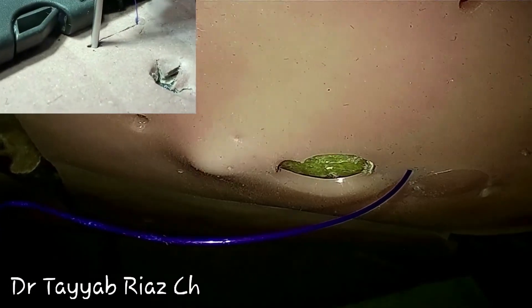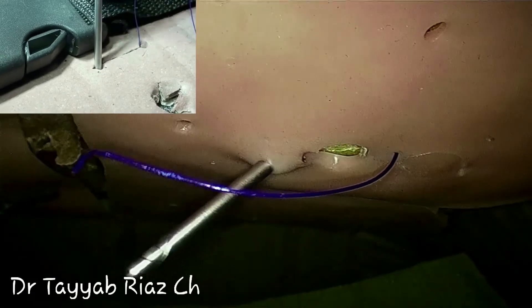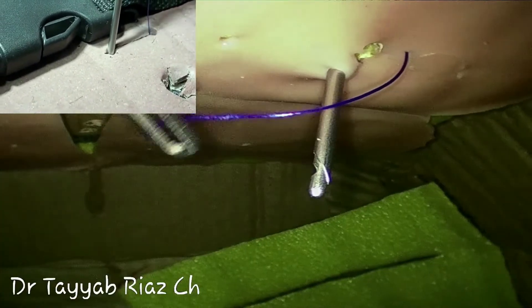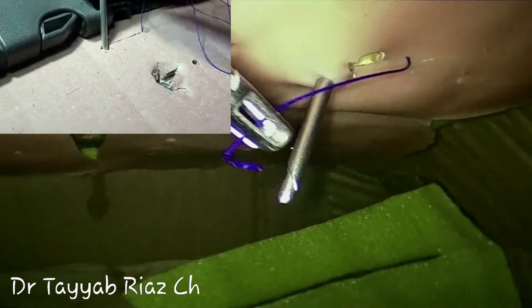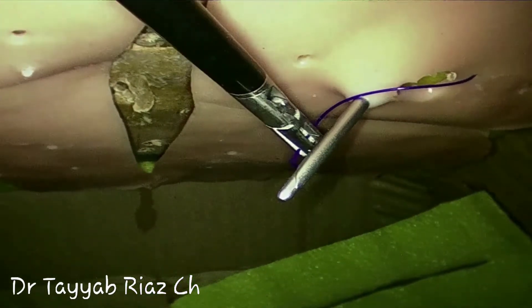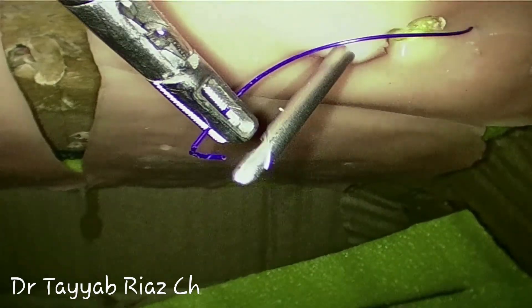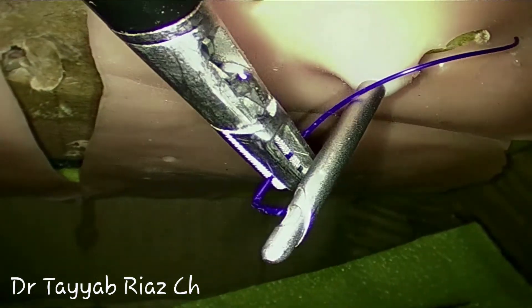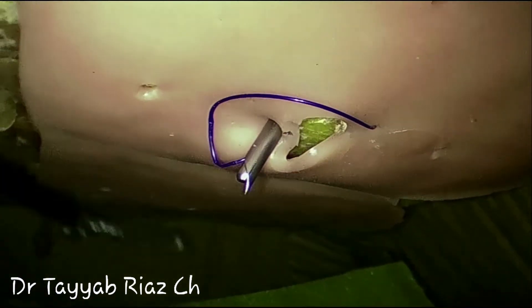Insert the needle again through the same 10 millimeter defect on the opposite side, again at the same distance. With the help of the left hand instrument, feed the end of the thread to the side eye of the Veress needle. This is a very fine movement and it needs rehearsal. After that, pull the stilet and bring out the end of the thread.